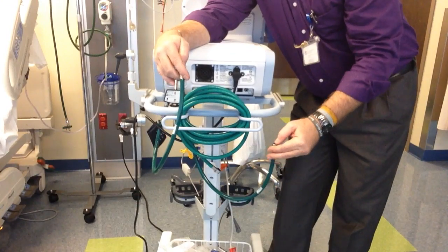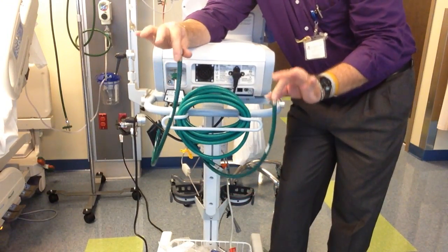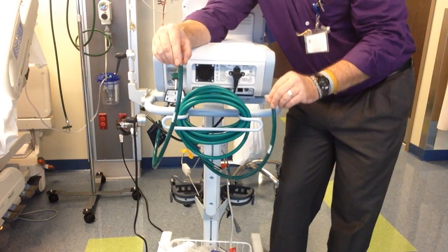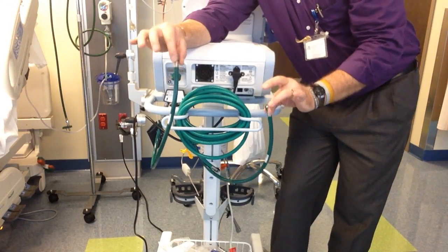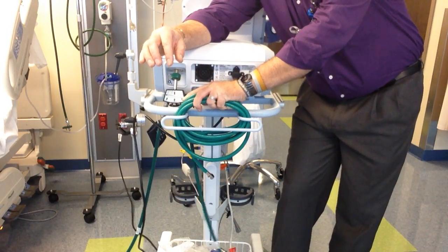When you are back in the hospital or back in the room and hooked up to the wall, disconnect from the tanks. This will prevent your tanks from being bled dry. You don't want to have to go on an emergency transport and you have empty tanks. So when you get back to the room or when you're hooked up to the wall, disconnect from the tanks. And that's where you'll hook up to the wall here.